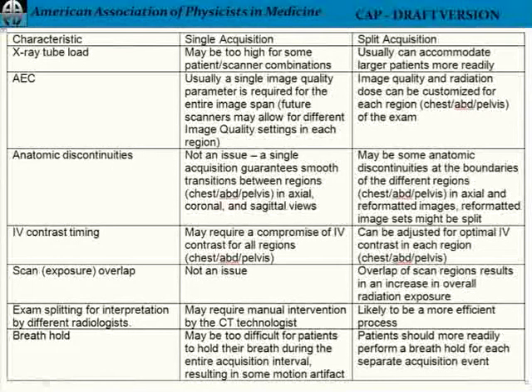With the chest, abdomen, pelvis, instead of axial versus helical, here there's a distinction between doing it all in one run, which is called a single acquisition, from like chin down to mid-thigh, or folks often will do that in separate acquisitions, say the chest separate from the abdomen, pelvis.